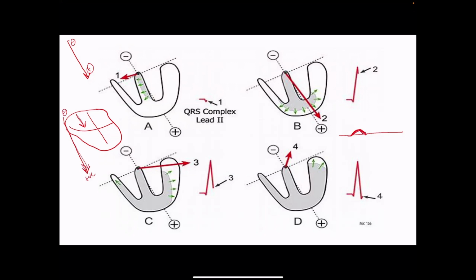okay? But did you ever wonder why the QRS or the ventricles depolarization goes down, then up, then down again, then up? It looks really different from the atria, you know? The reason for this is this first notch of the QRS, which is the Q, is because when the ventricles depolarize, the first thing that depolarizes is the septum, and it depolarizes from left to right.